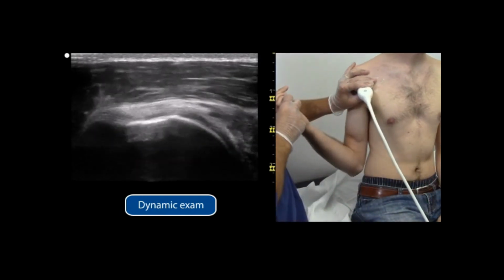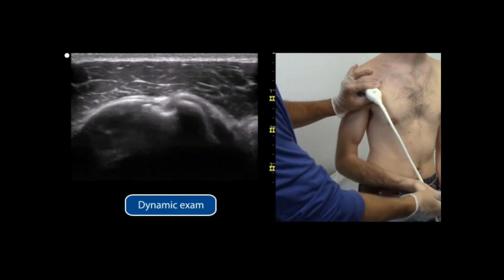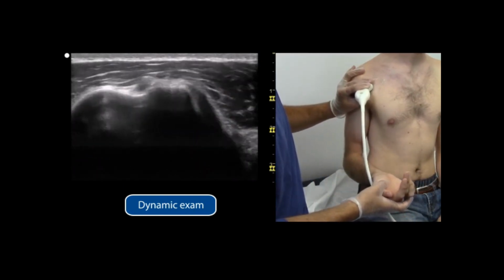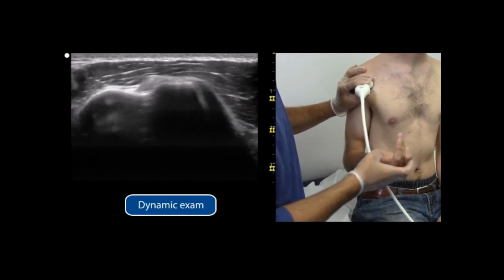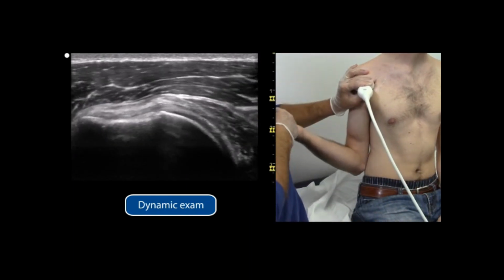Musculoskeletal ultrasonography is a dynamic exam. One can have the patient actively range his or her joints under real-time ultrasound imaging. This will enable dynamic visualization of entire tendons and muscles as joints are taken through their standard ranges of motion. Finally, recognizing and mitigating anisotropic artifact is critical to performing MSK sonography.